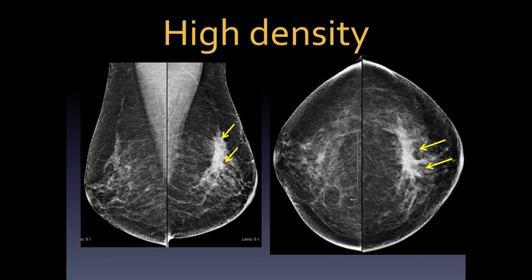Single-view asymmetries have only about a 1.8% chance of being malignant. If it's a new finding or a baseline, we would typically investigate with tomosynthesis or ultrasound and confirm that it represents normal glandular tissue. Here are three different examples of asymmetries seen only on the CC projections. Ultrasound showed a cyst, sclerosing adenosis, and a small cancer respectively in these three patients — so it's very difficult to say which will be malignant. We typically investigate with ultrasound and additional mammographic or tomosynthesis views.